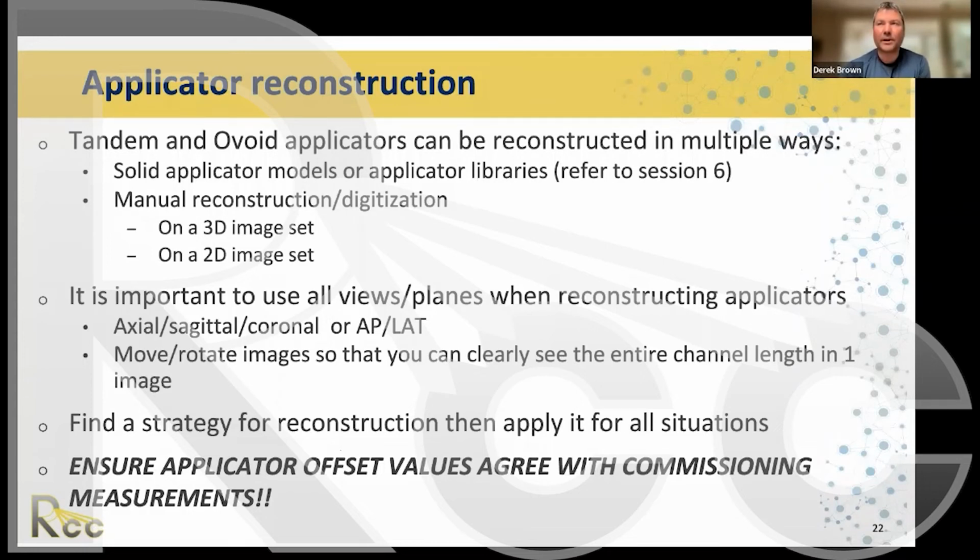And for all of this, this is a really important point. I know we're coming up to our timeline here. For all of these things, efficiency matters, right? So we're going to image our patient, and then we're going to do this digitization, contouring, and treatment planning, right? The longer we take to do digitization, optimization, and treatment planning, what happens? The more opportunity our patient has to move. And if our patient moves, then we're going to mistreat them. So we want to do this correctly, and we want to do it efficiently.